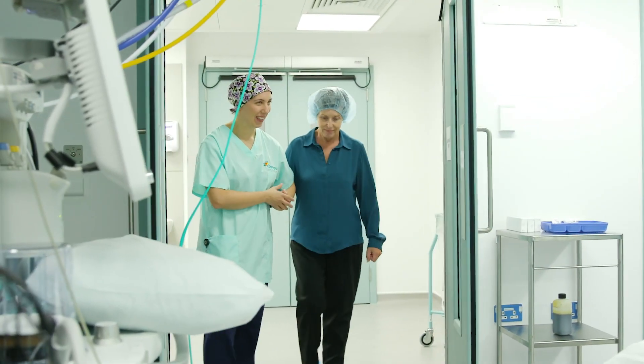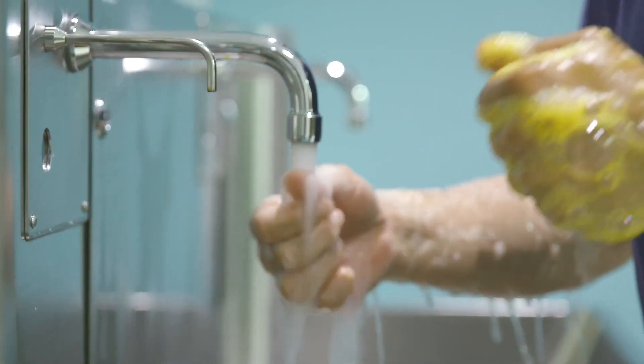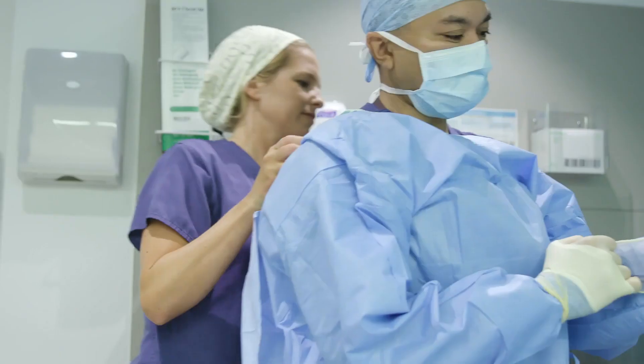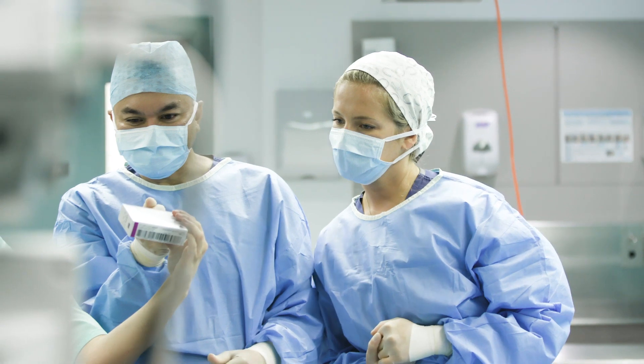What you want to look at is the risk of a never event while increasing your productivity and maintaining accuracy and precision. And that's where EQ Workplace really comes into its own. That comfort actually transfers itself to the environment, the atmosphere, and also to the patient on the day of surgery — it makes them more relaxed as well.